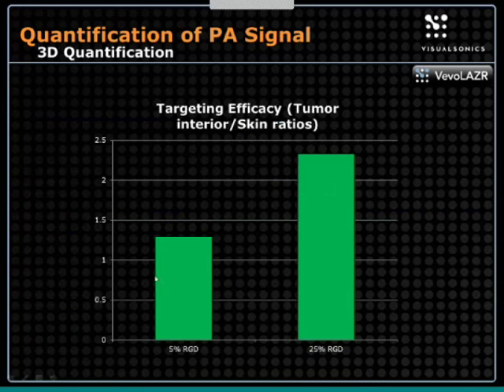Again, not really that surprising. We would actually hope that that's true, but now we're able to look at the pharmacokinetics and the microdistribution and put those two pieces together and actually learn something about targeting efficacy. We can learn about targeting efficacy versus just nonspecific uptake. This is a simple graph. It's only 4 animals. It's early data, but it's very, very promising. Really nice, powerful technique here.